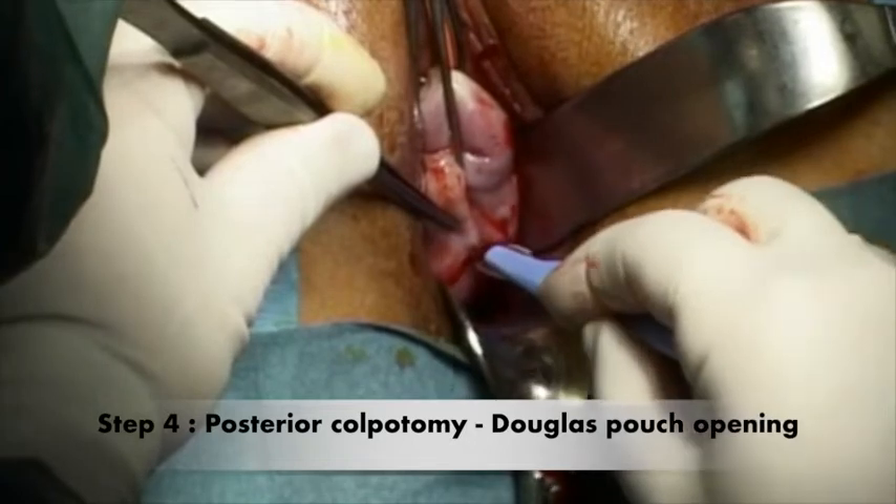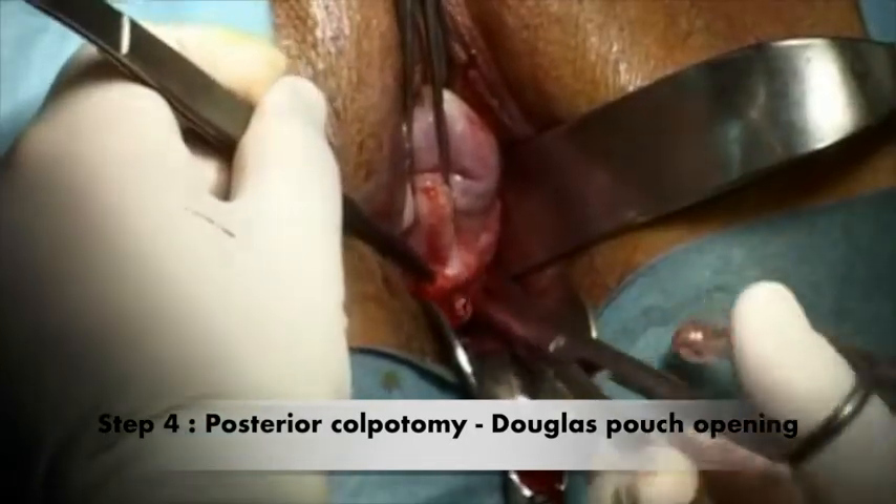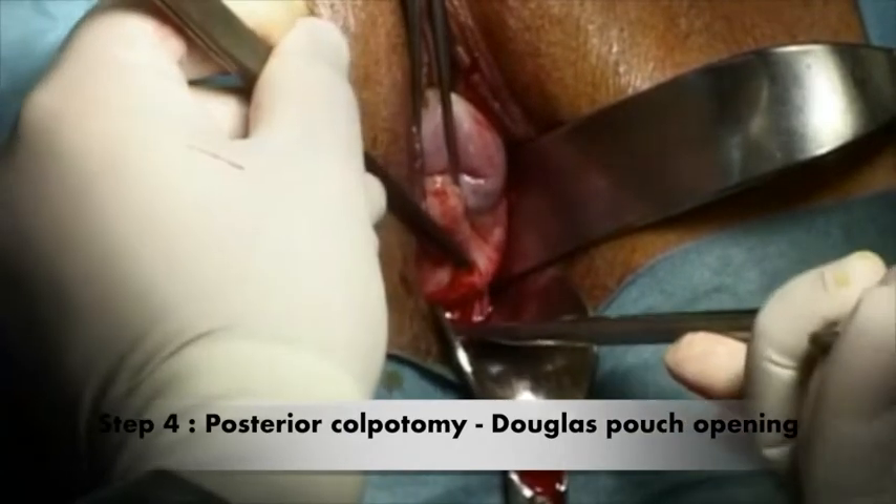The fourth step consists in performing a posterior colpotomy with a scalpel and opening the Douglas pouch with a straightforward scissor cut.